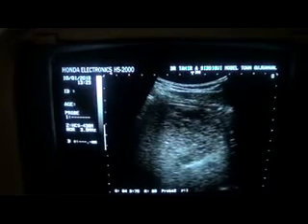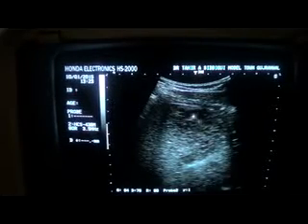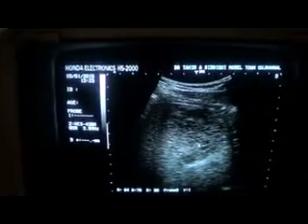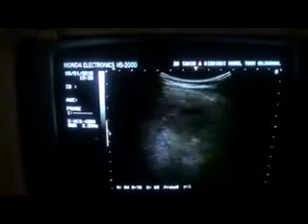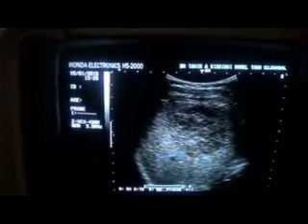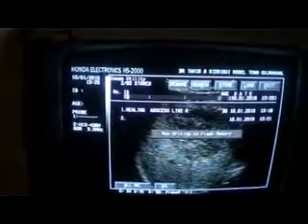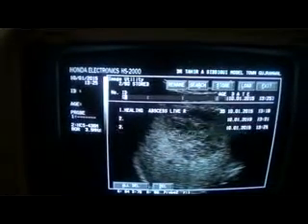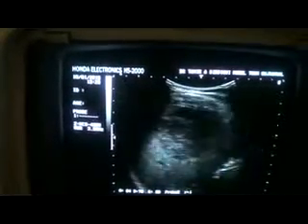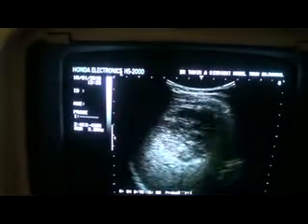If it is absolutely thin or the echoes are of low level, then the needle will be of a different bore. So this is good information for the surgeon, or if you yourself want to get rid of this cystic area. So this is an abscess of the liver in healing phase, because the patient has been on antibiotics for at least 1 month with Flagyl.